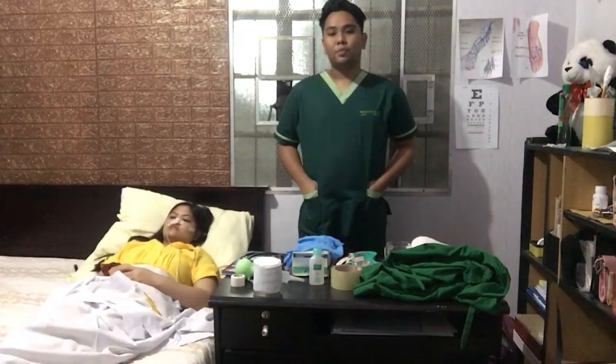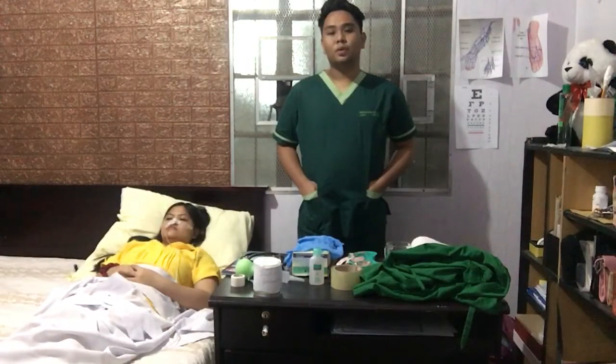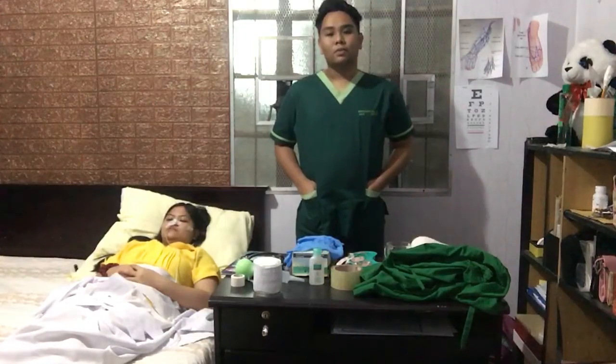And today I'm going to perform all about the NGT. So the purpose po is to provide adequate nourishment to patients who cannot feed themselves. Second one is to administer medication. And third is to provide nourishment to patients who cannot be fed through mouth, like yung surgery in oral cavity, unconscious patient, or in comatose state.